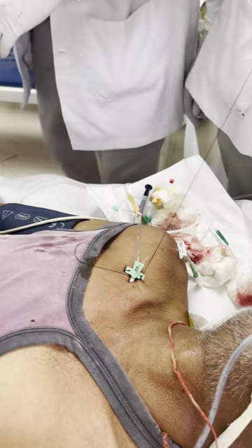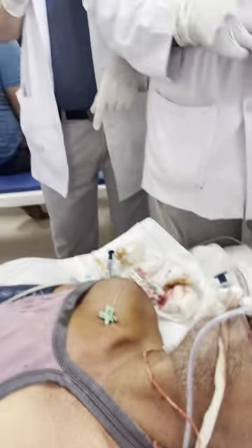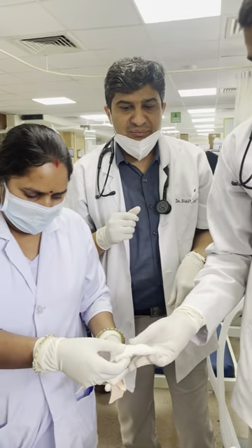No, sister, cut off. Clean karta betadine se. Suppose the area near the line is getting necrotized and so many things are taking place.